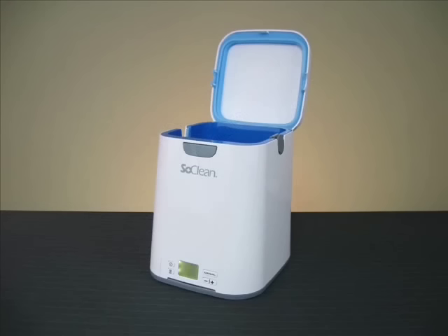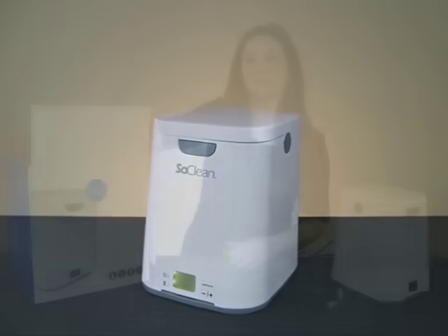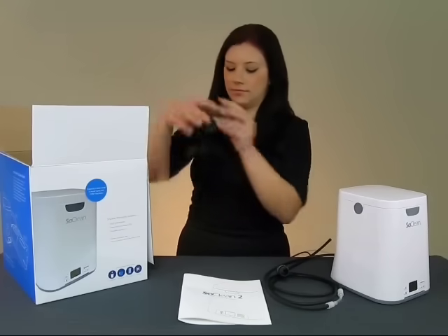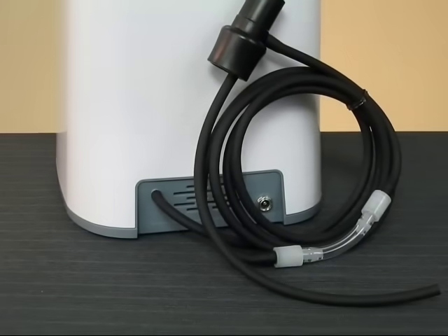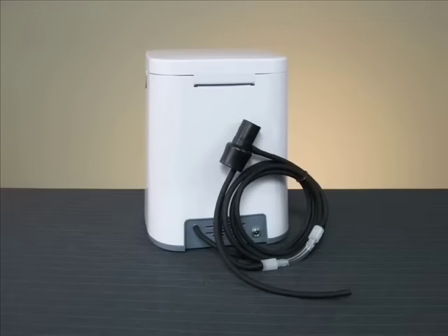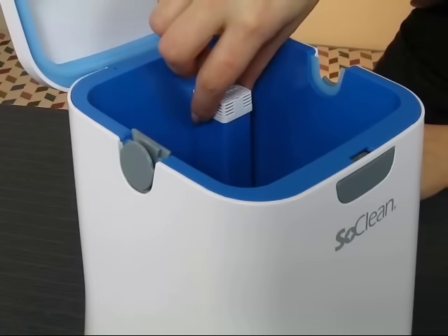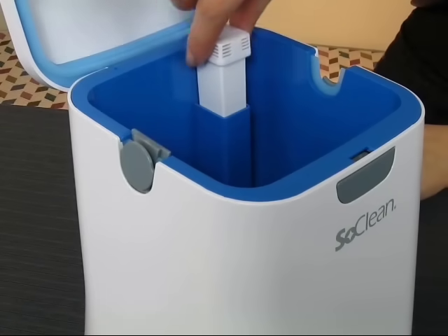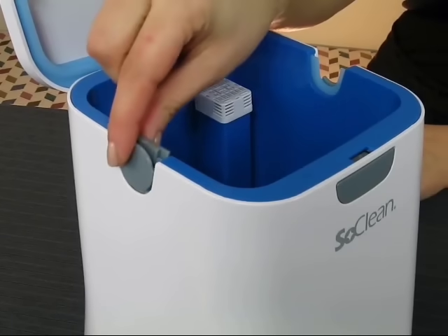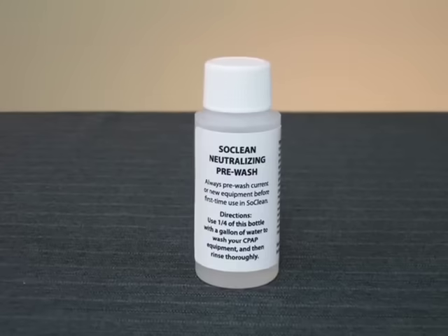Let's start off by getting familiar with the box contents. Along with the main SoClean unit, you'll find a user guide, power adapter, and an injection fitting connected to the SoClean by a length of hose. Along this hose, you'll see a check valve assembly. Installed inside your SoClean are a filter cartridge and a hose slot plug.